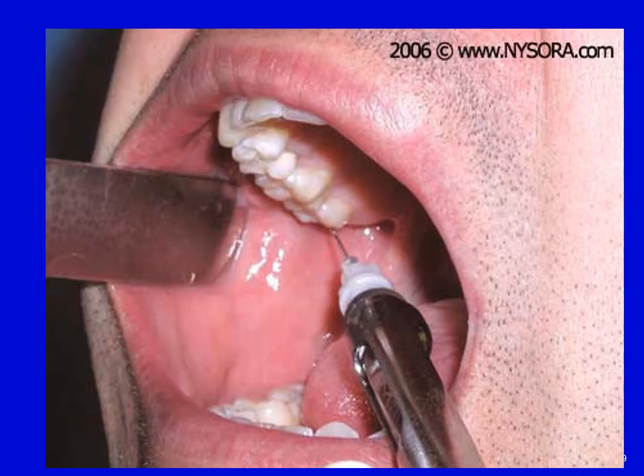This is a far better and more realistic picture of what you're actually going to be looking at. So the needle is going to go behind, or distal to, the last molar, but it's up at the height of the mesial palatal cusp of the second molar, or possibly the third if it's there. So that's how you can tell how high it's going to go, and then you just move it distal of the last tooth, and there you'll inject.